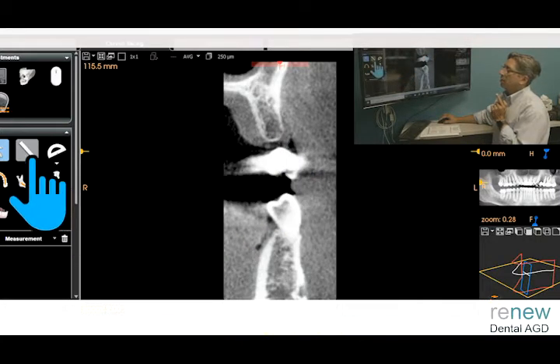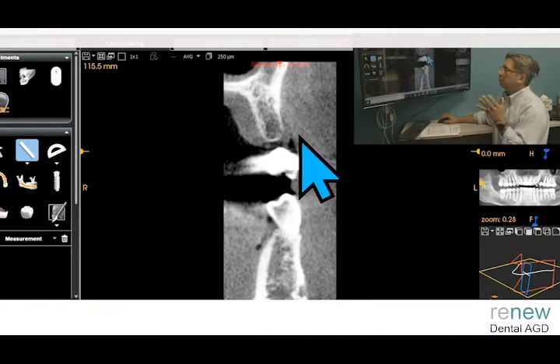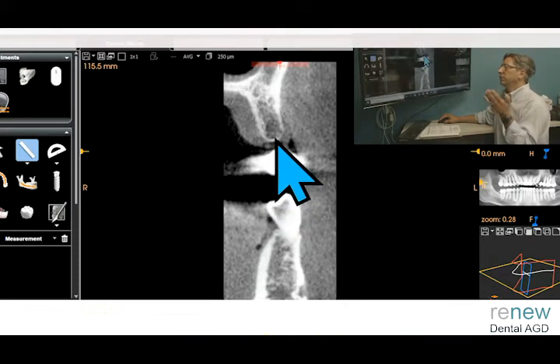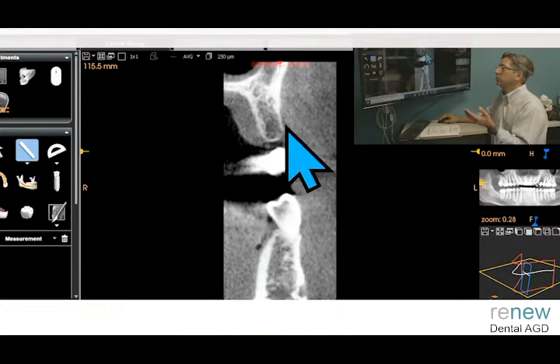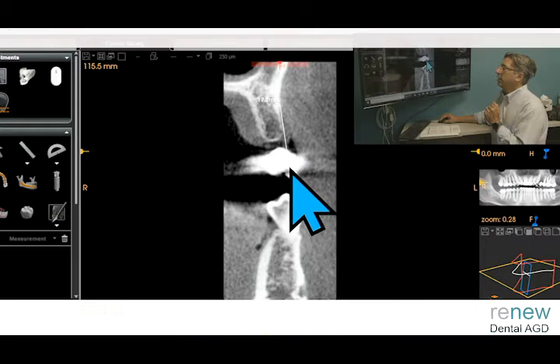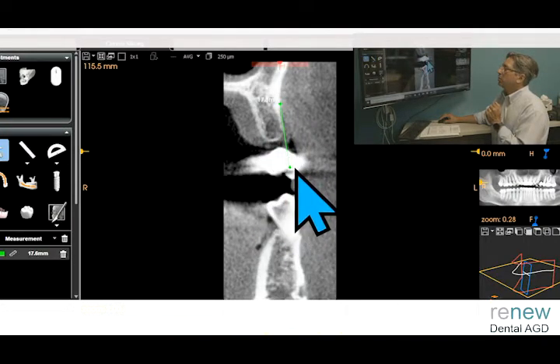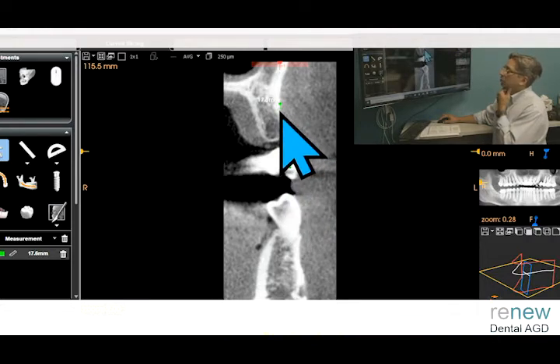And what I do here for teaching doctors how to kind of judge their angulation, especially if you're doing a flapless surgery in this kind of scenario where it just seems so straightforward, you can take a perio probe and pretend this is the tip of the perio probe. You know that this is the angulation of the perio probe is straight along the wall.